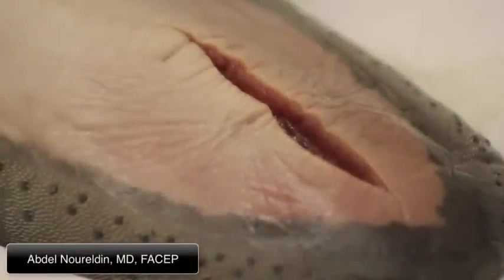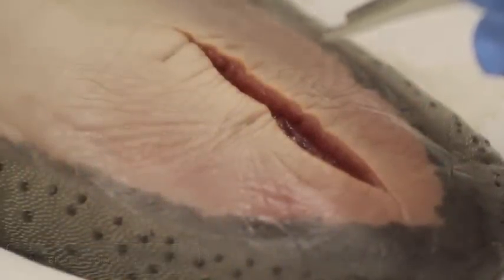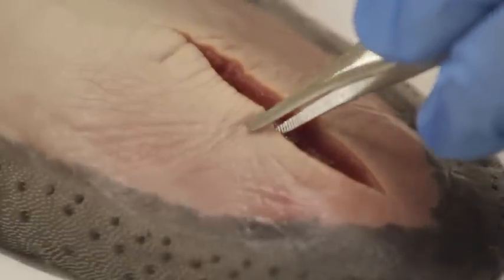Now we're going to show you how to do a simple interrupted stitch. Number one is your needle driver and your forceps. Your needle holder and your forceps should be like a knife and a fork when you're eating — you should always use them together.